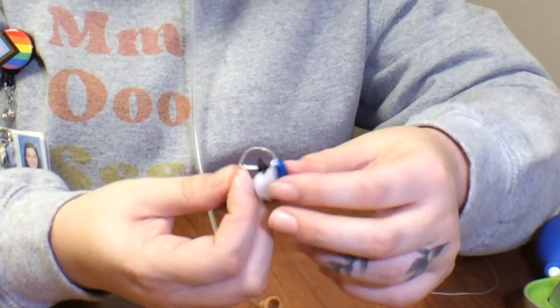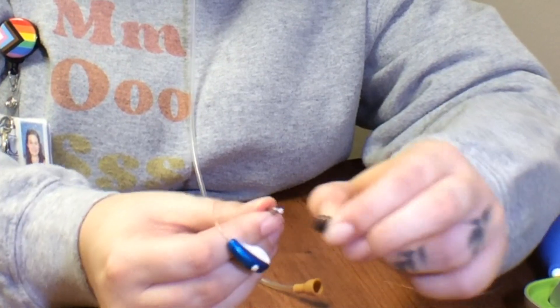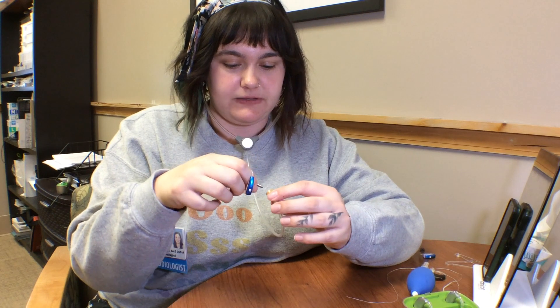But if it sounds distorted or weak, you'll also want to check to see if maybe the dome itself is the problem. Most of them are grip tips, so you can just pull right off the tip, and then you'll put the end of the receiver down inside your listener.